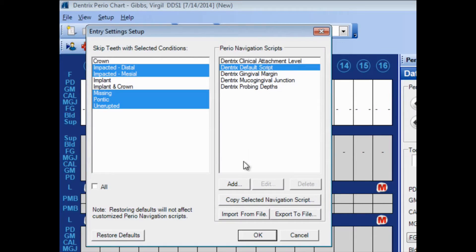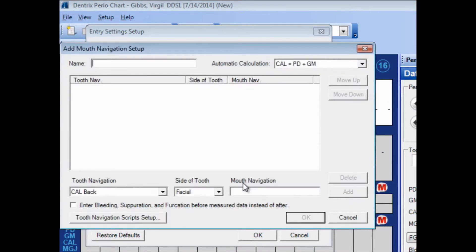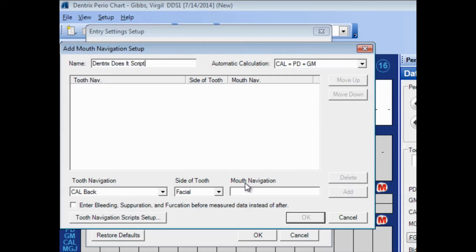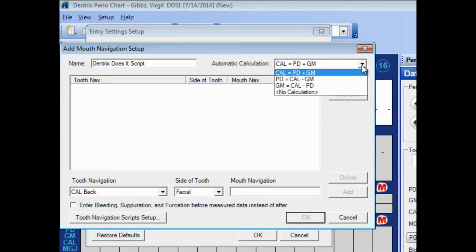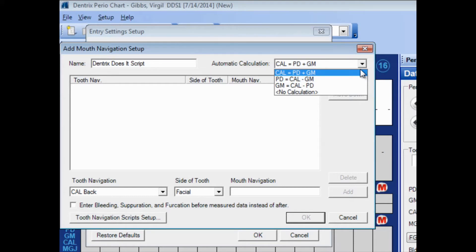I'm going to click Add to create my own. I'll name my script. I'll choose here in the top right corner if I would like it to automatically calculate certain numbers. The clinical attachment level, or recession, can be figured by adding the probing depth and the gingival margin if I choose to enter both of those values. And that will be fine. I'll go ahead and accept that.